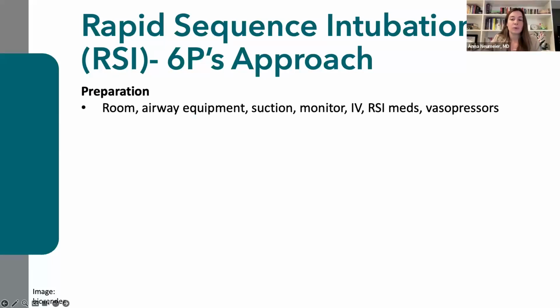Your first P is your preparation. Ensuring that you have a standard approach to how you prepare for the procedure will guarantee that nothing is missed. You should prepare your room, ensure that you have the appropriate airway equipment, that suction is present, that the monitor is connected with vitals cycling quickly, ideally every 3 minutes.